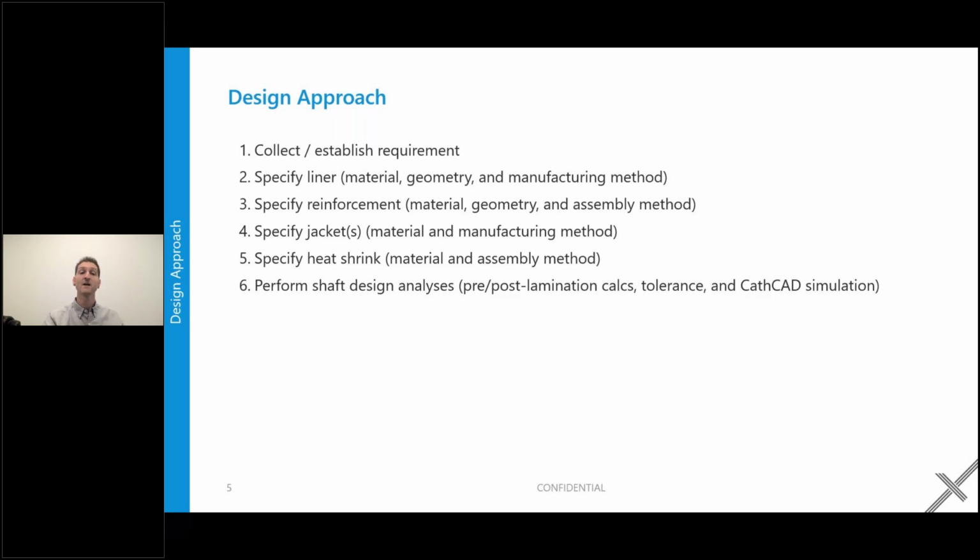Then we're going to specify the heat shrink materials. There are a few different types that have their pluses and minuses for different applications. And then we'll do a shaft design analysis. We'll do some calculations. We'll do some testing.